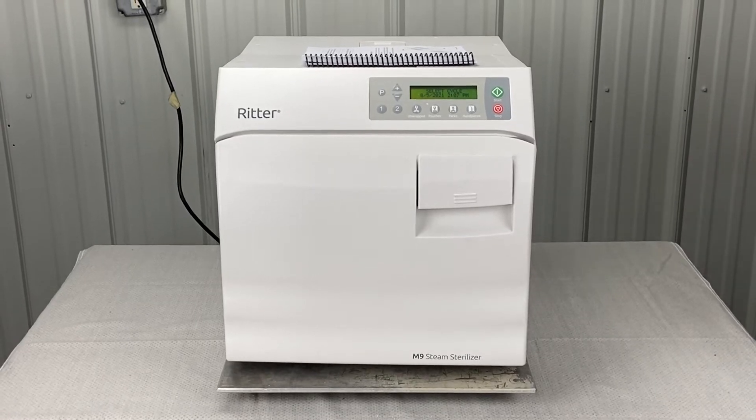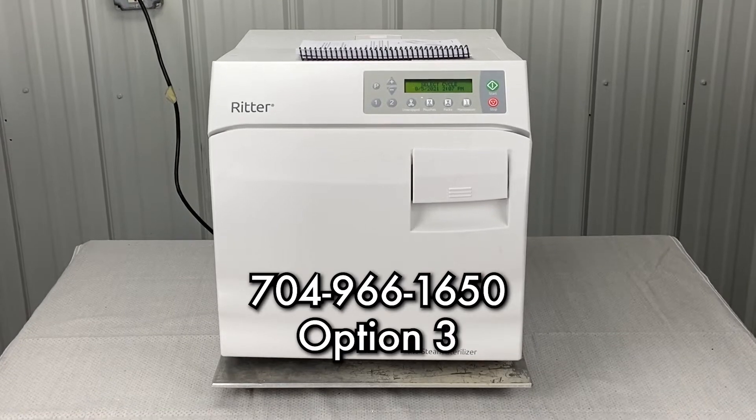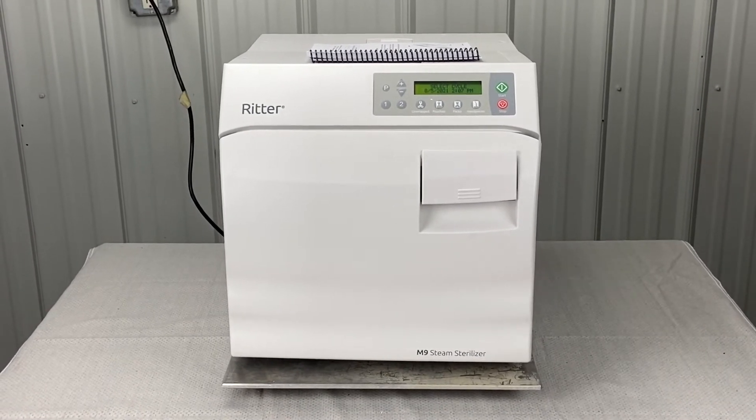Andrew here, Sterilizer Autoclave Solutions. 704-966-1650, option 3 for free technical support. Right now we will talk about weekly maintenance.